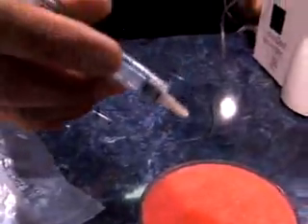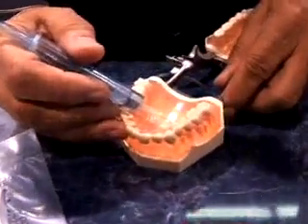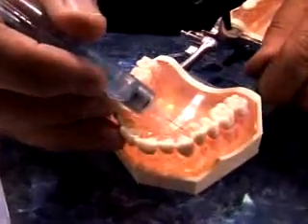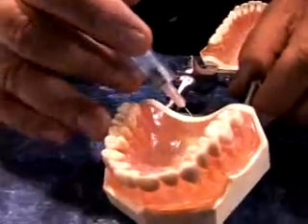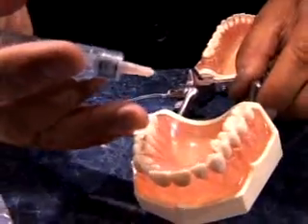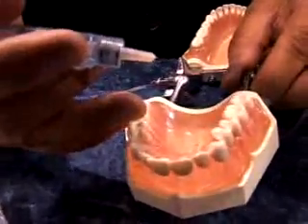Because of this technology, we can give injections on the palate that numb multiple teeth without numbing the patient's lip and face. We can give an injection in this area called the AMSA, which will numb 5 teeth, all the related tissue on the palate and the buccal tissue, but not numb the patient's lip and face. And this is a great benefit to both the patient and to the dentist.